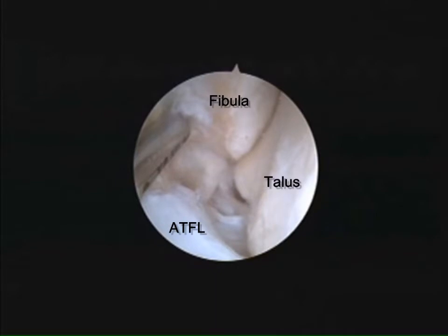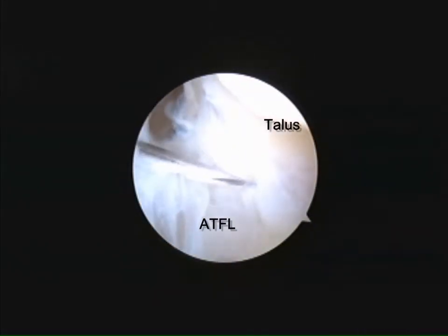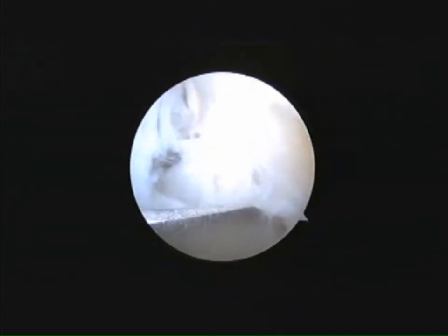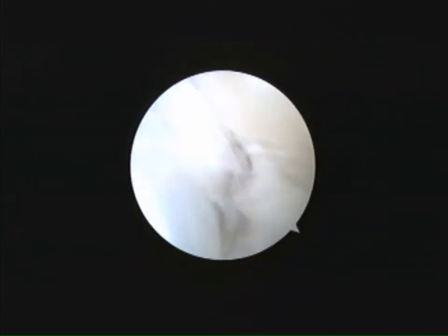The patient is placed in the supine position. Standard anteromedial, anterolateral, and accessory anteromedial arthroscopic portals are used for this procedure.